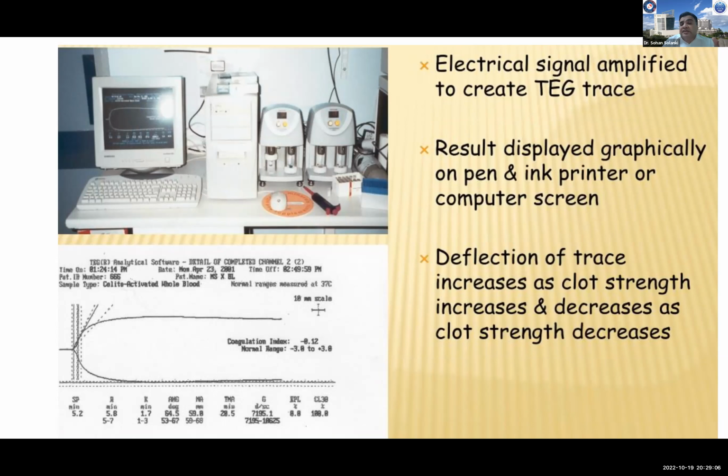and the signals form the TEG tracing. And that tracing is then displayed on paper or a computer screen, and the deflection of this tracing depends on the strength of the clot.